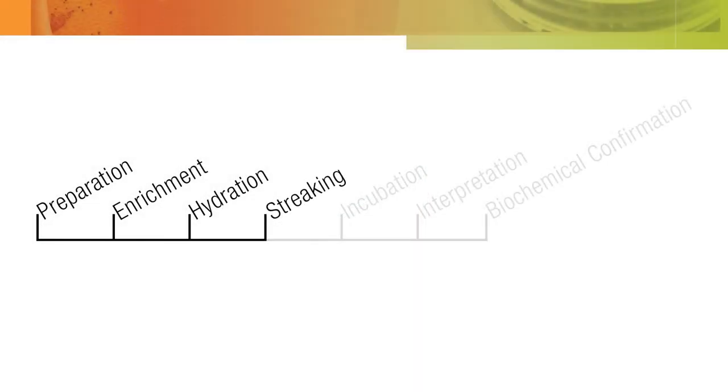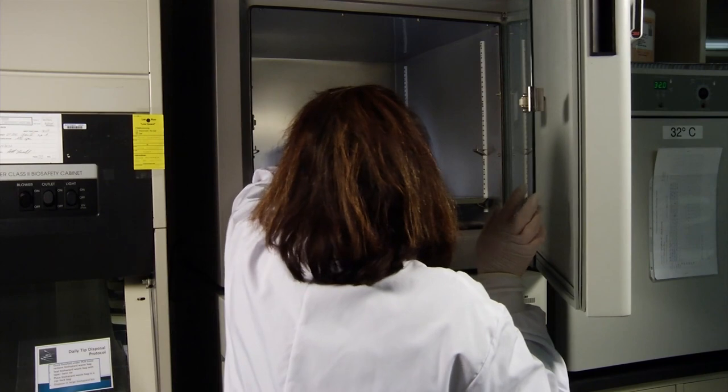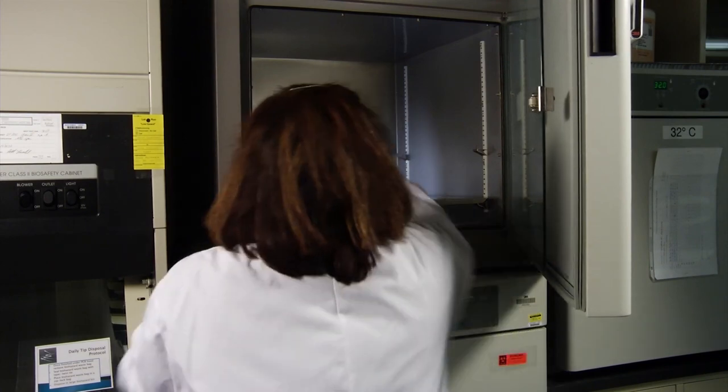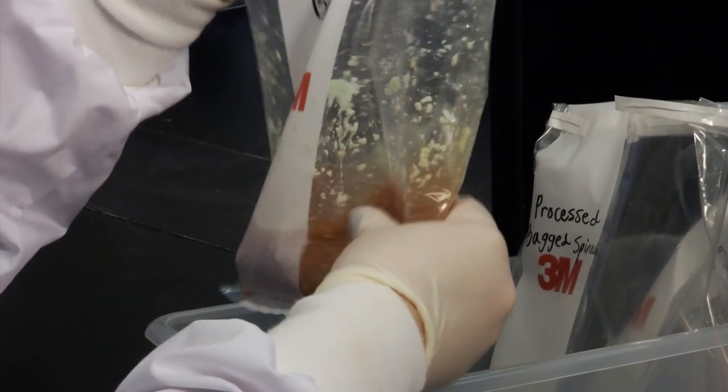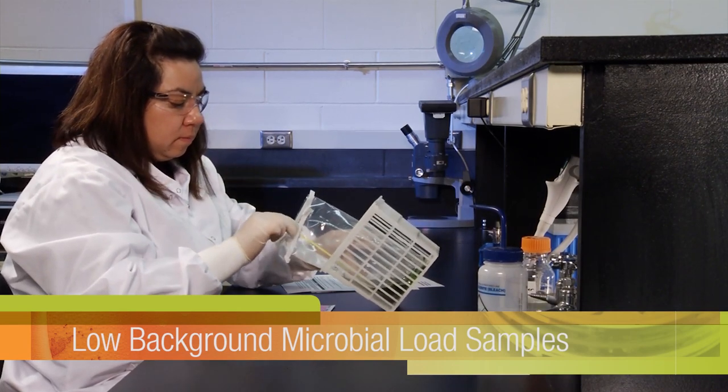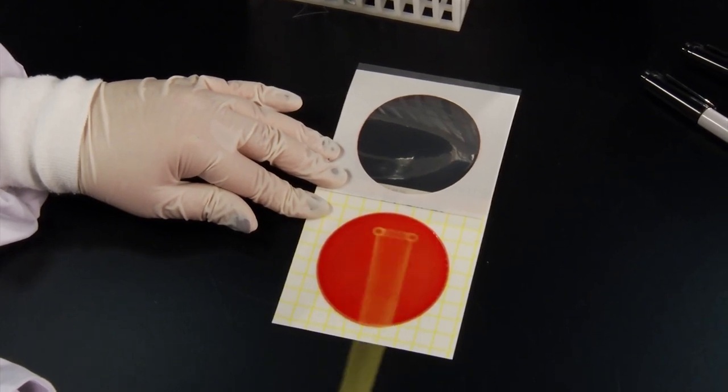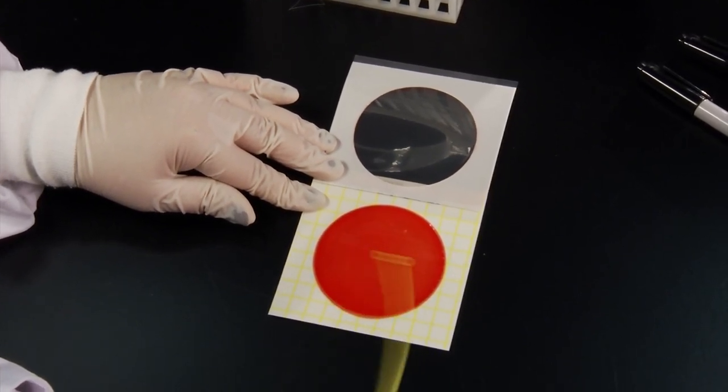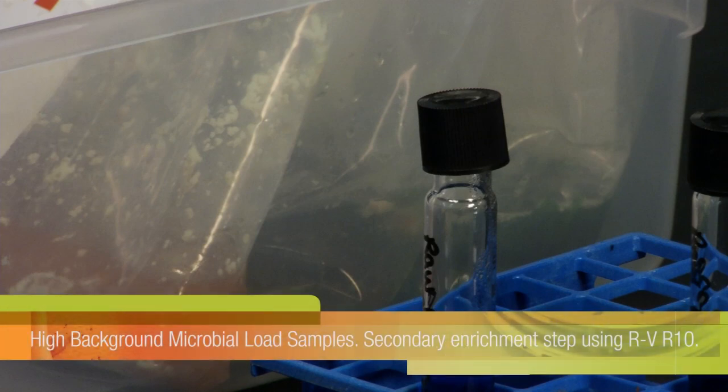The next step is streaking your enriched product samples onto the pre-hydrated 3M PetriFilm Salmonella Express Plate. Remove the enrichment medium from the incubator after the required incubation period and agitate its contents by hand. For low background microbial load samples, proceed directly with streaking the enriched sample onto a hydrated plate. For high background microbial load samples, perform a secondary enrichment step.